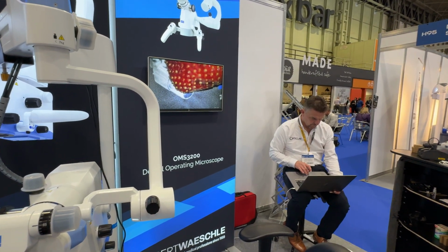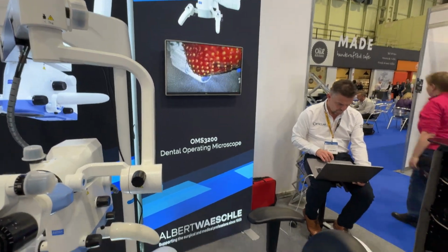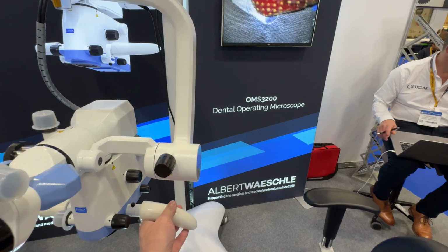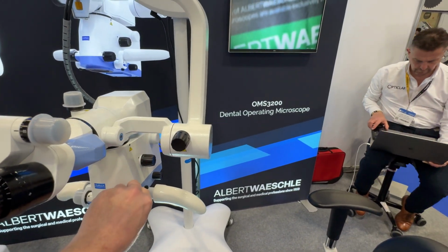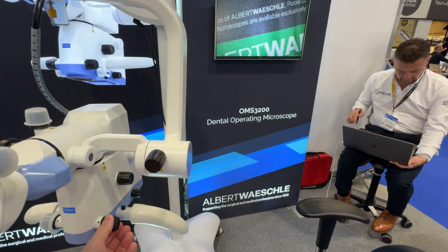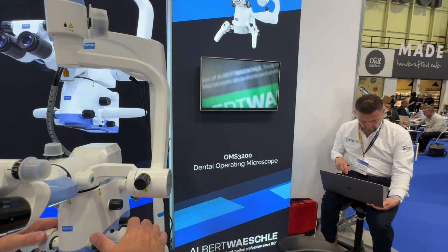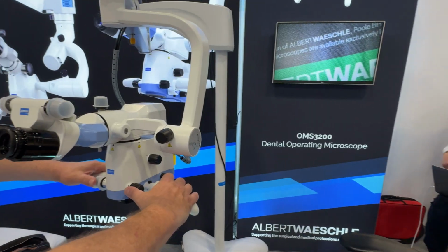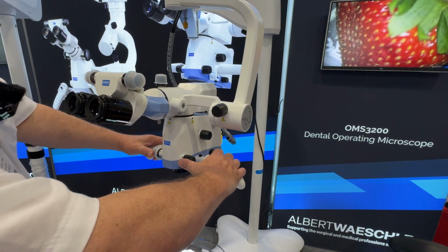And do you know what? Straight into focus. You move that actually quite significantly. If people aren't used to microscopes, moving your scope like that, even a tiny bit, is a lot. But just a tiny little movement, that's really nice. And it's in a really nice position because where your handles are, that's where your thumb would naturally fall. So I tend to use that with my thumb. And then get that focus back on the fruit there.